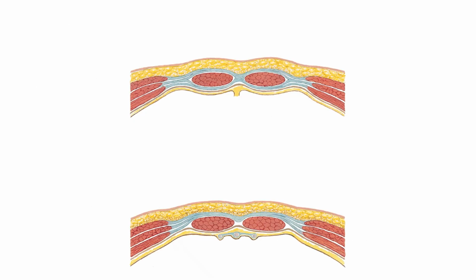In this slide, I want to return back to this image of the layers of the abdominal wall because I want to give some clarification on the double click test. When they push the Veress needle through the layers of the abdomen, the first click they're going to feel is because they're going through that muscle fascia. So the first click will be here, typically around the linea alba if they're going through the medial abdominal wall. And then the second click is going to be going through the peritoneum. So again, first click, the muscular fascia, second click through the peritoneum.